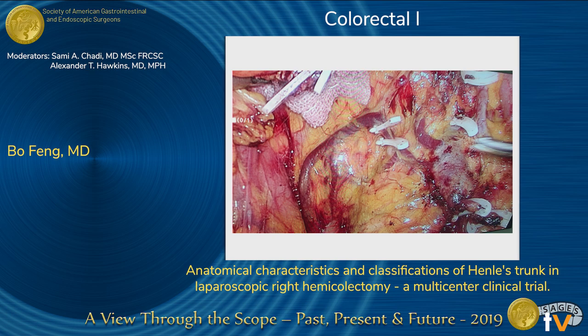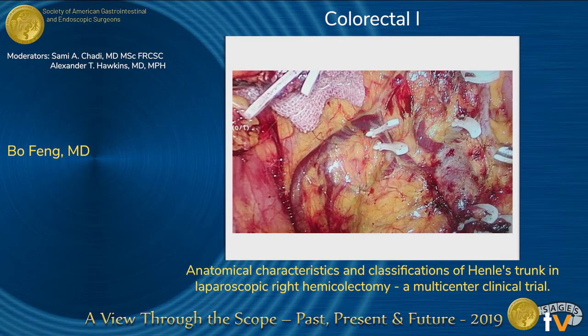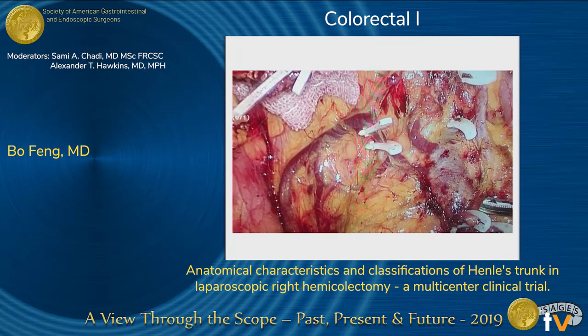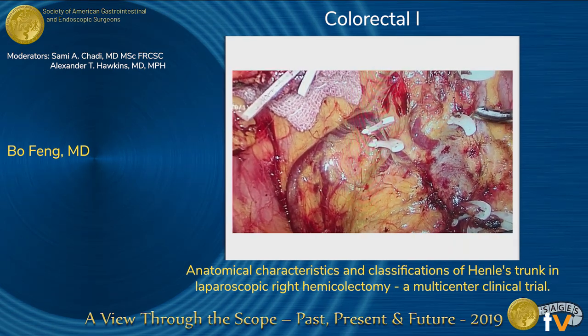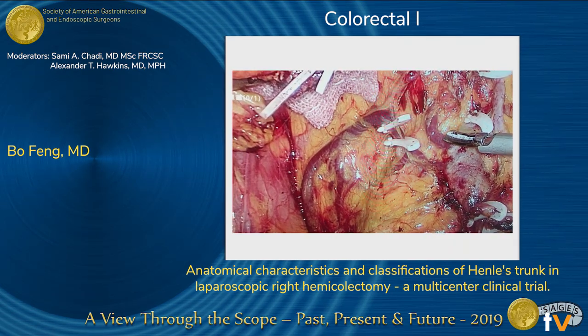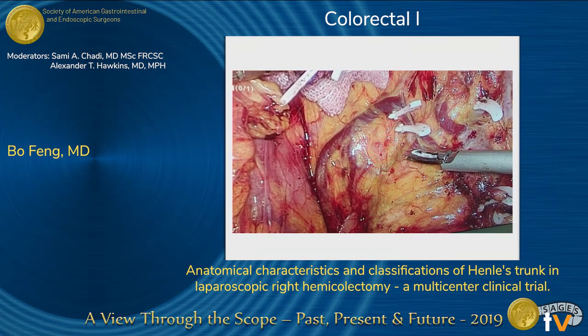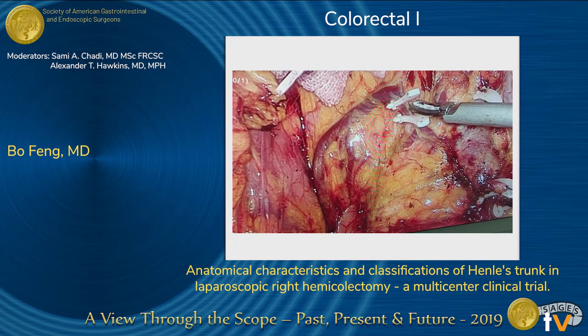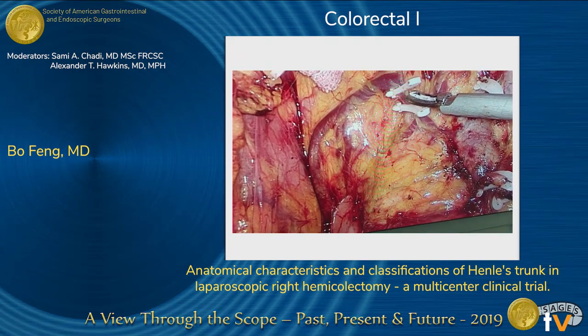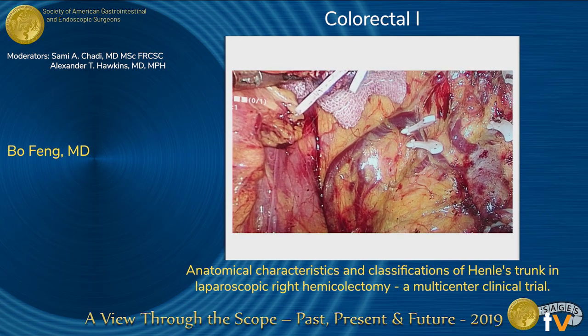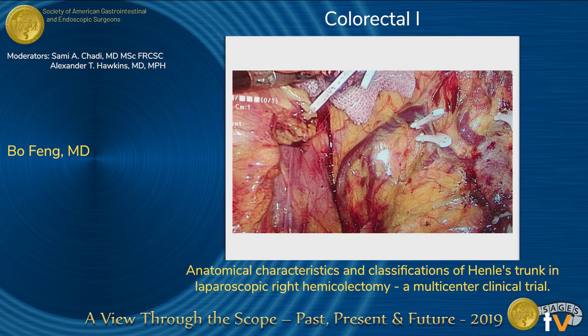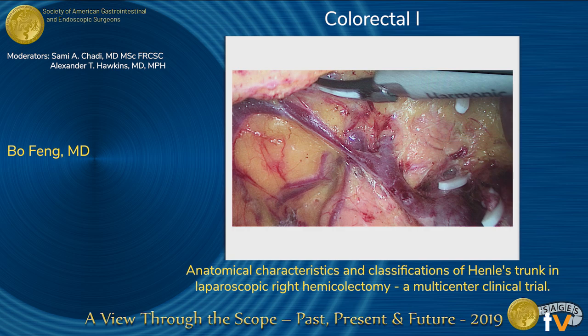This is a type 3 case. And this is the very interesting case I mentioned — the other type. In this case, Henle's trunk is missing and the right gastroepiploic vein originates directly from the SMV. There is only one vein originated from the colon that has been dissected here. This represents another variant type.